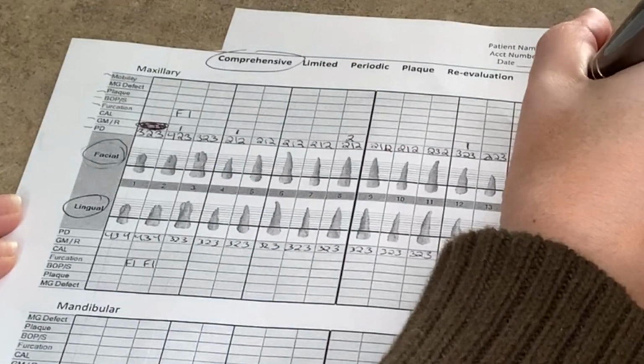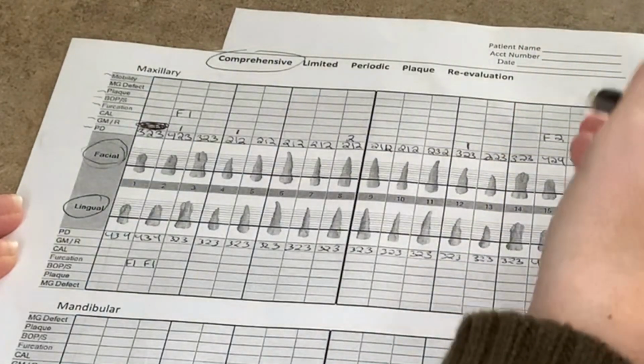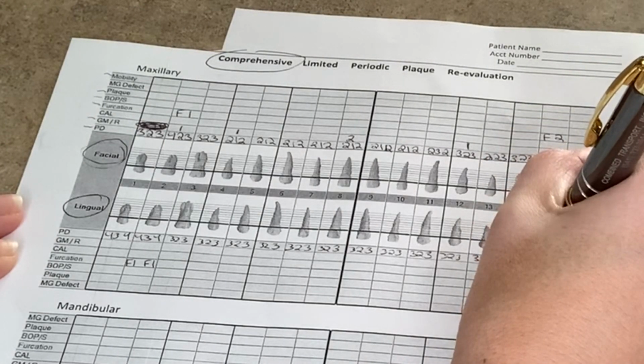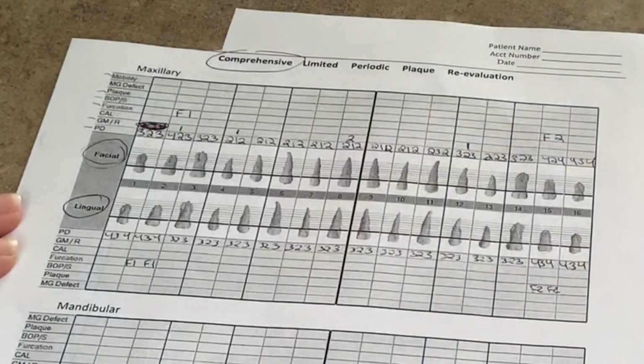So I'm writing those in right now. And you can see that on the facial I'm putting 1 reading, and on the lingual I'm putting 2.